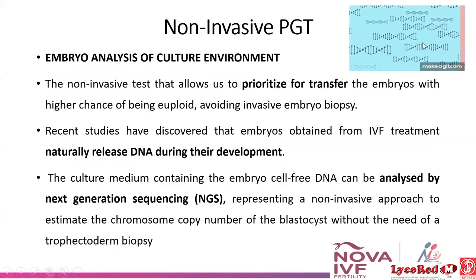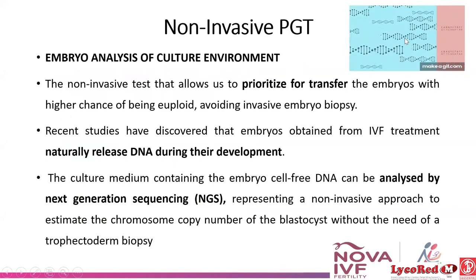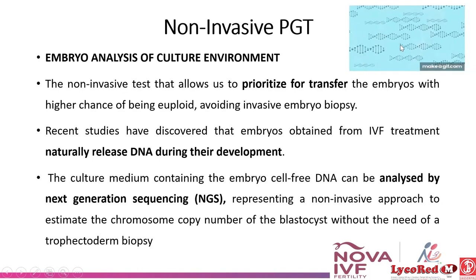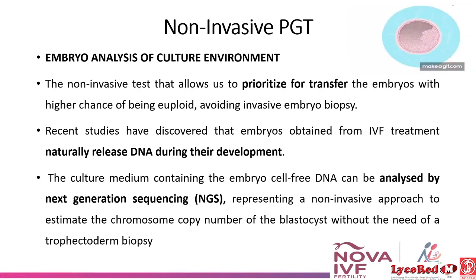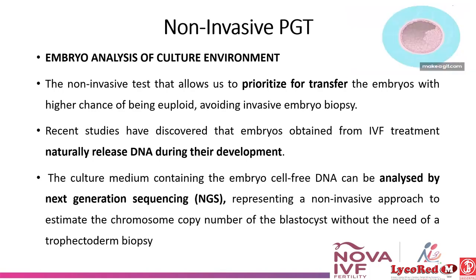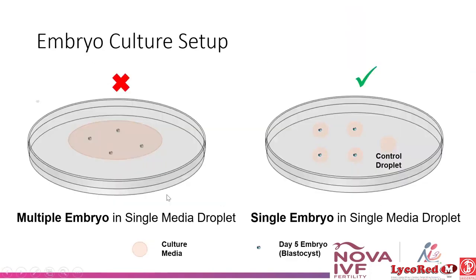It is an embryo analysis of the culture environment. We collect the media where our embryos are growing. The non-invasive tests allow us to prioritize embryos for transfer. Recently, studies have discovered that embryos obtained from IVF treatment naturally release DNA during development, and that DNA can be helpful to detect whether they are euploid or aneuploid. The culture medium containing the embryo's cell-free DNA can be analyzed by the NGS platform.